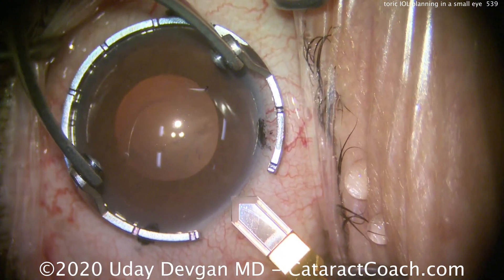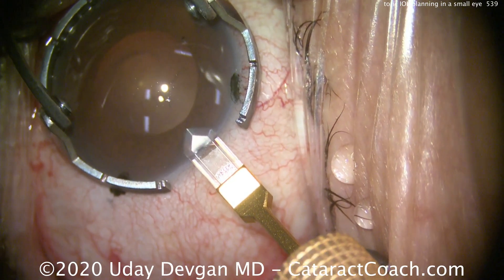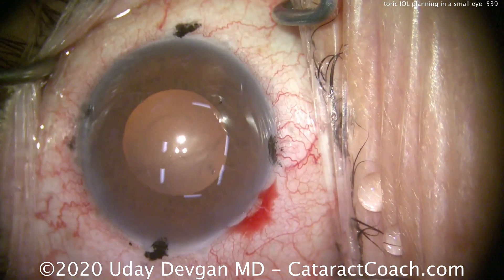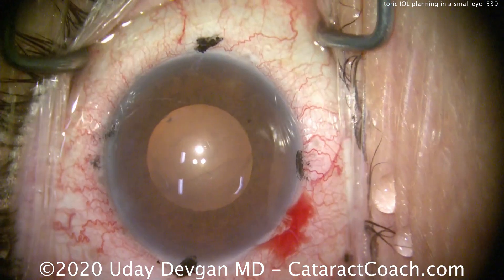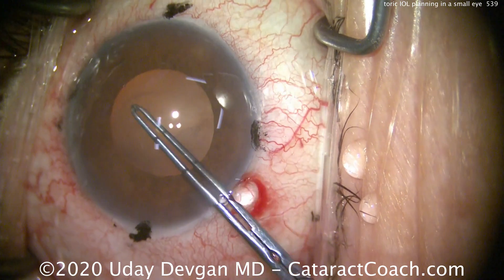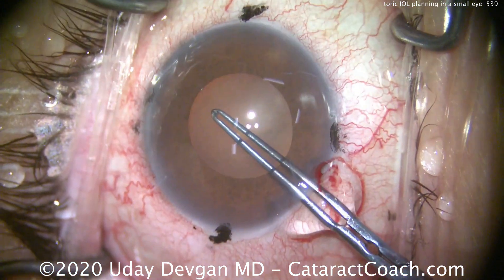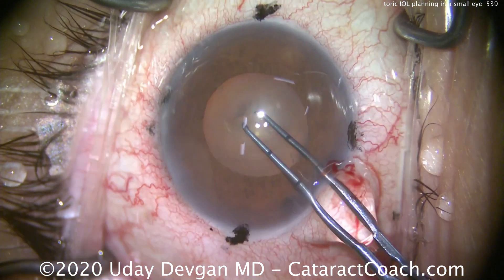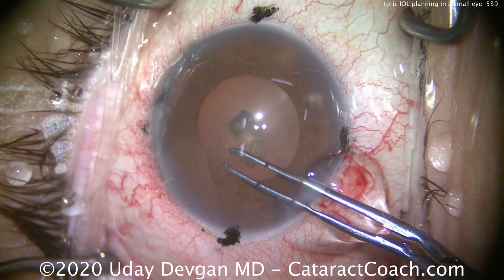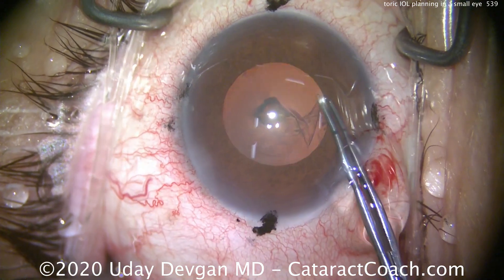Operating on that steep axis is going to help the astigmatism, and more importantly we're not going to change the direction of the astigmatism. Remember, astigmatism is a vector which has magnitude and direction. If you make your incision on the steep axis — or even on the flat axis — you'll change its magnitude but you won't change its direction. If however you make your incision somewhere else, like at 180 degrees instead, you would change not only the magnitude of the astigmatism but also its direction, and that makes it problematic.